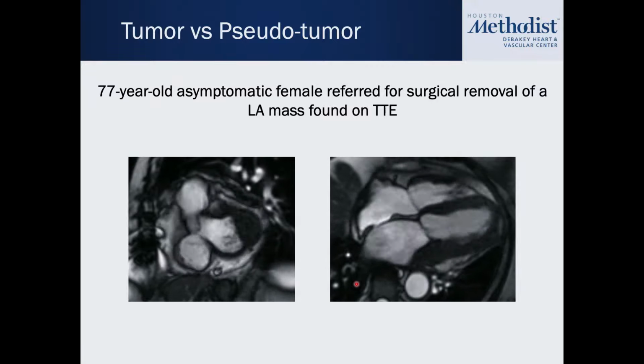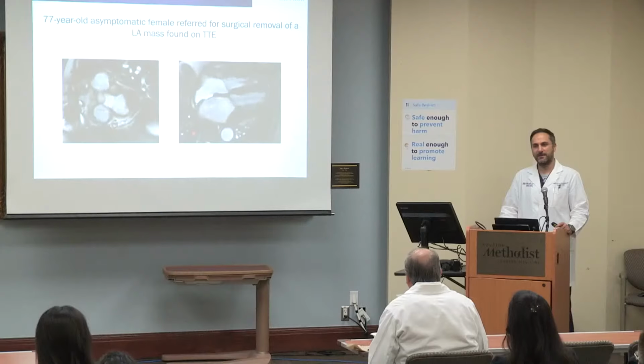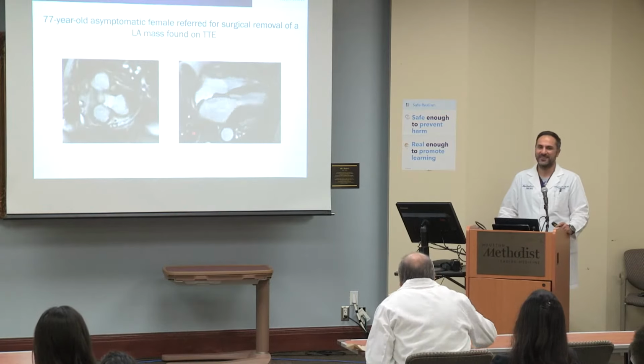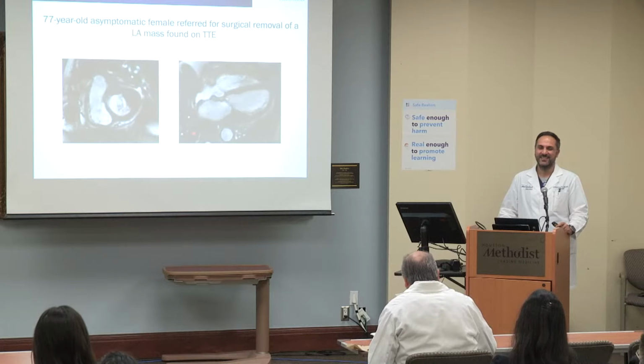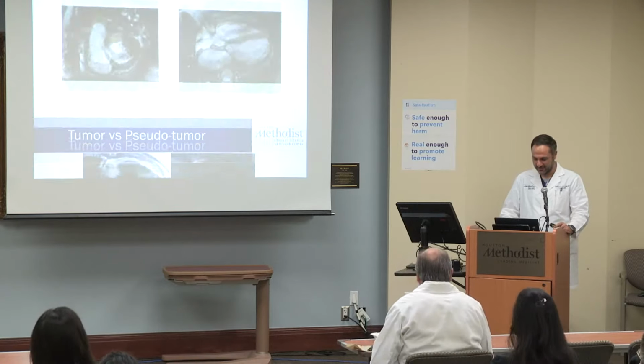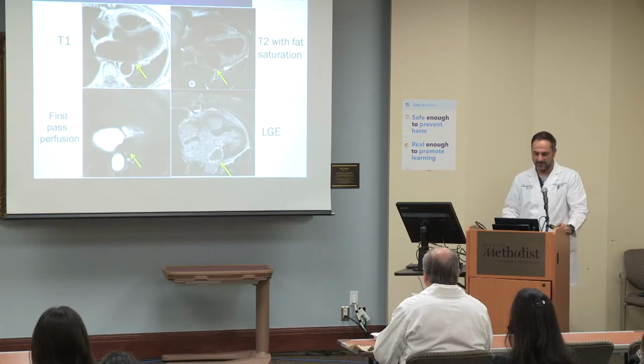Is this how you see a mitral annular calcification? Is it? I've never seen such a mitral annular calcification. Can you go one step further? Yes. So this patient got an MRI, right?